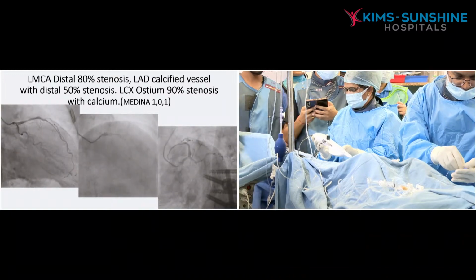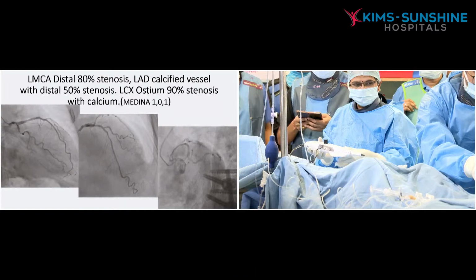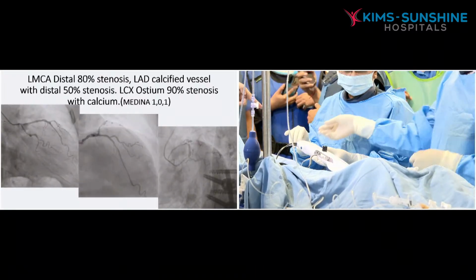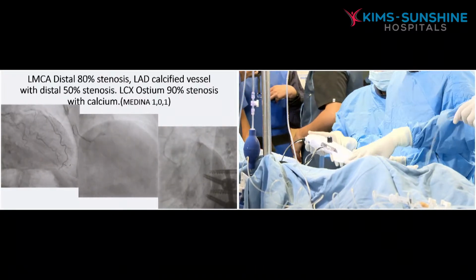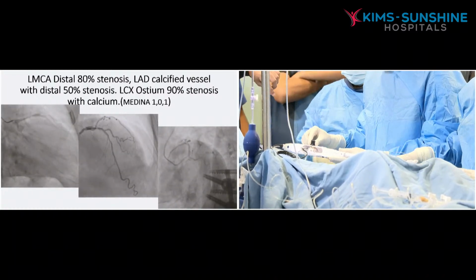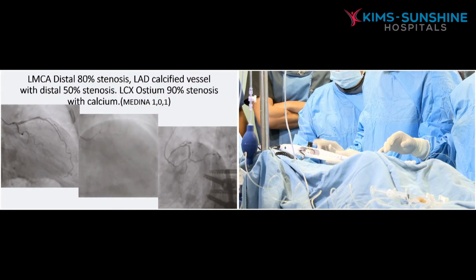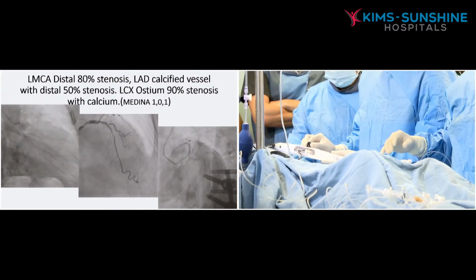So I'm checking the draw steps, sir. Tip is coming. Bifurcation is checked. Advancer is also checked. Wire also came. Wire is checked. So sir, unfold. Open it, sir. Unlock it. Unlock. Clockwise, and just take 2 fingers gap forward. Forward and lock it. Lock it, sir.